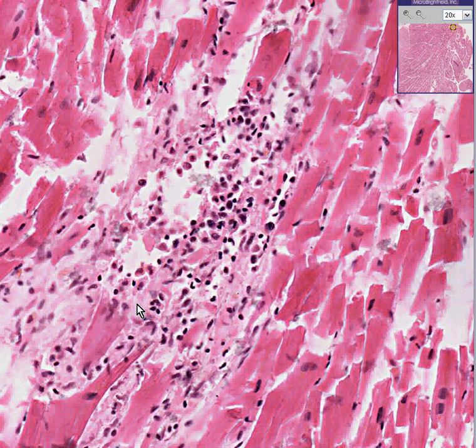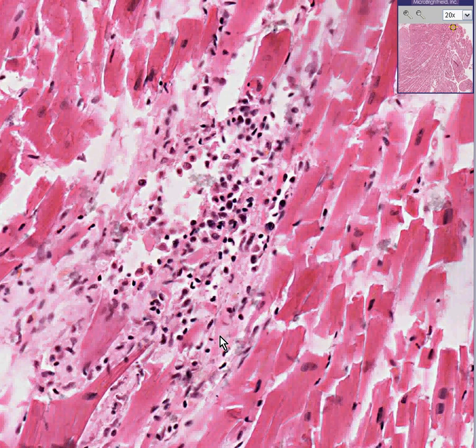It isn't. This is just a nonspecific myocarditis — toxoplasmosis by history.